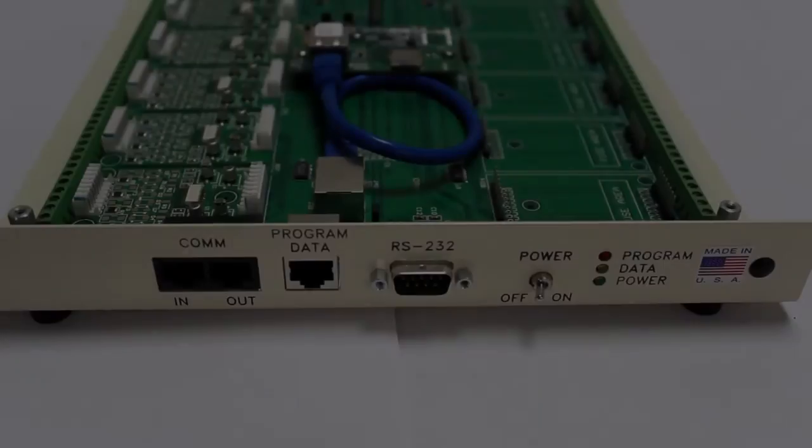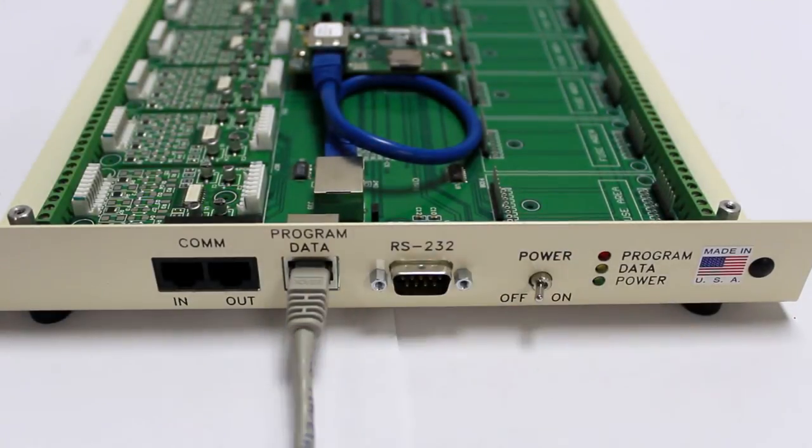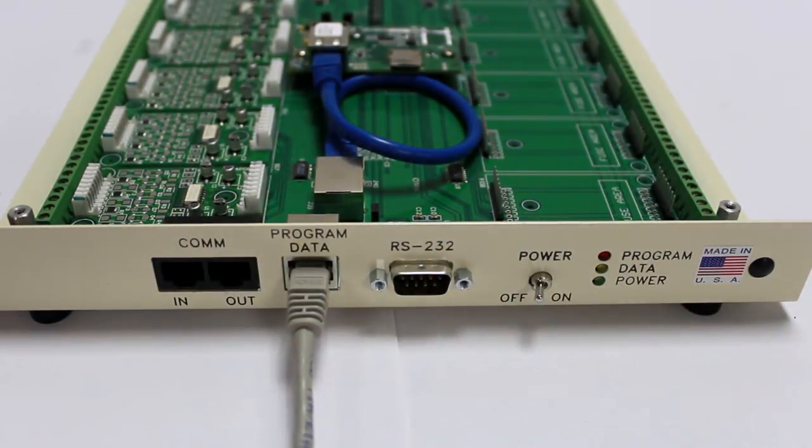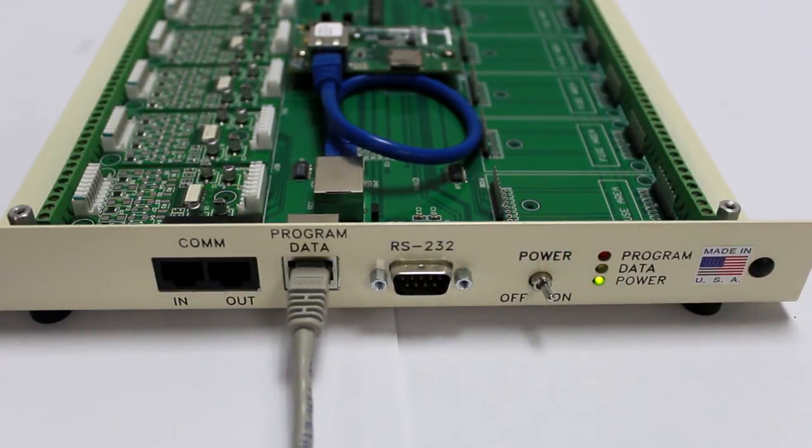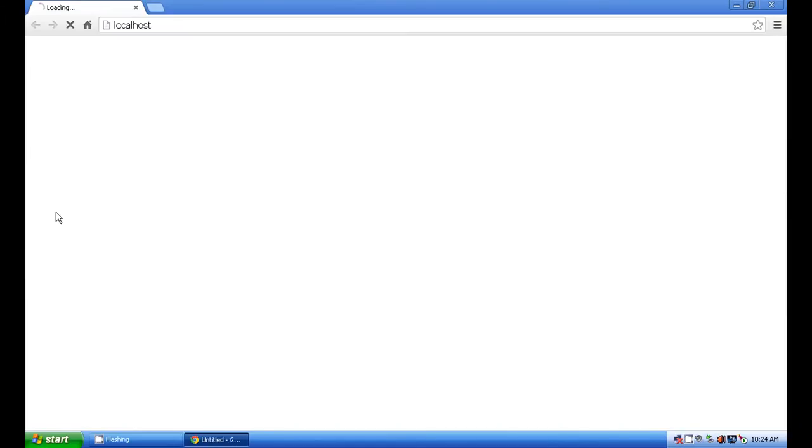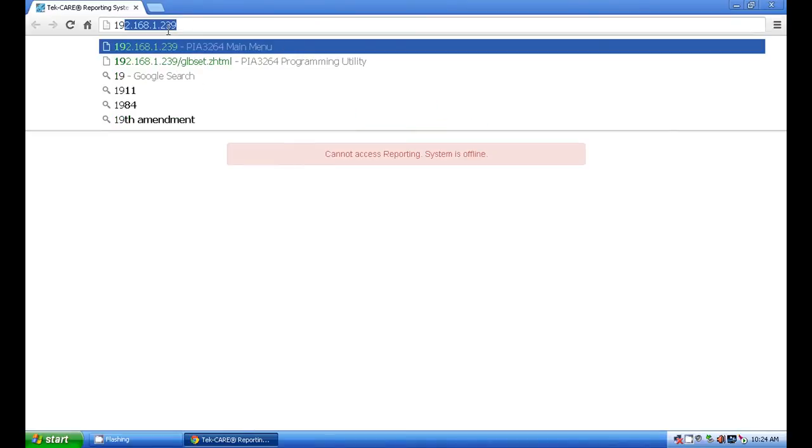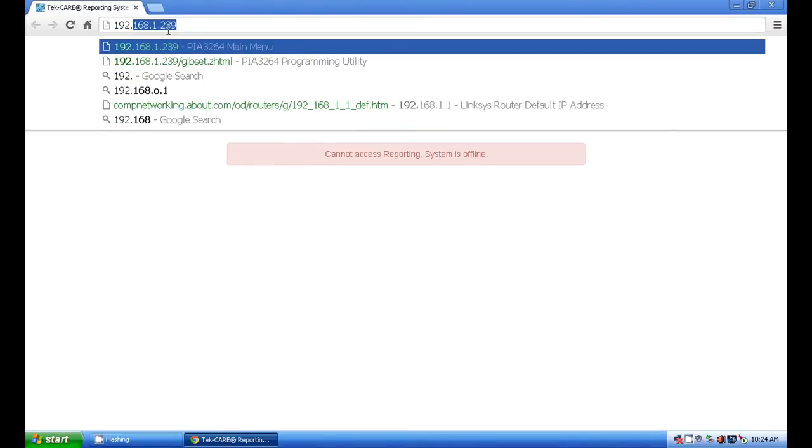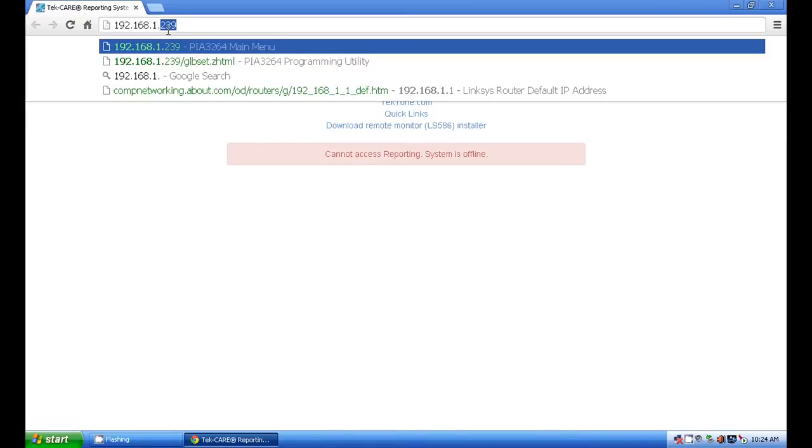Use the included crossover cable to connect the NC377 to the TechCare network port on the rear of the TechBridge. Open a browser window on the TechBridge and type in the default IP address of the NC377. In this case it is 192.168.1.239.